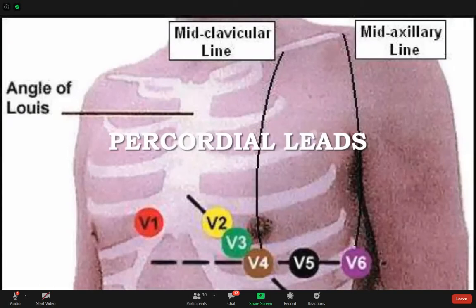In positions where? When how many electrodes you need to attach to have full ECG? والليفت ليج هذه الليمب 3 هذا أحمد. So يلا start أحمد again. بس ما كنا نسمعنك أول شيء انقطع. يلا.